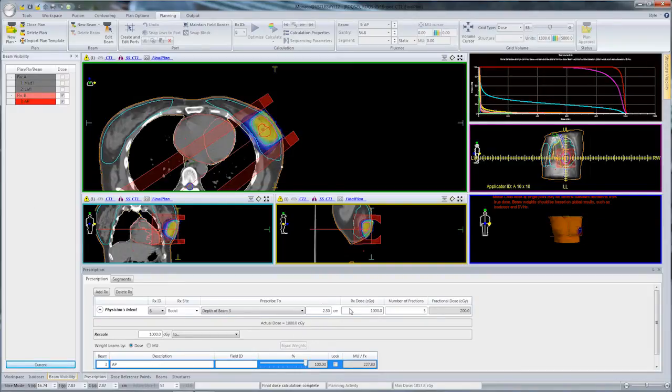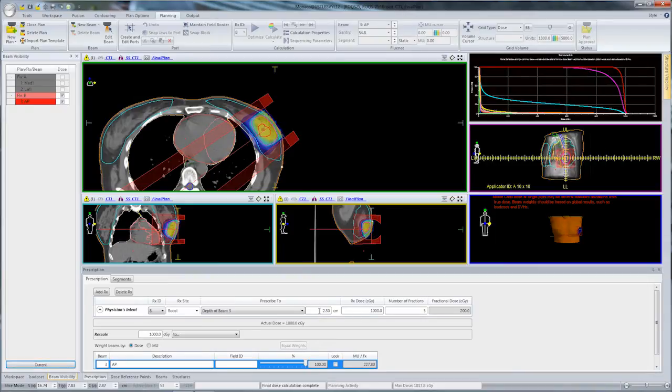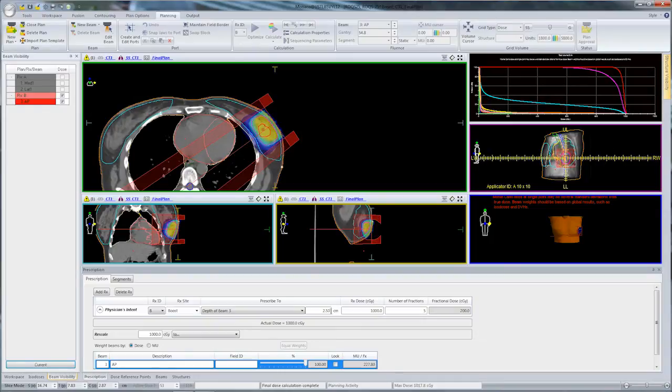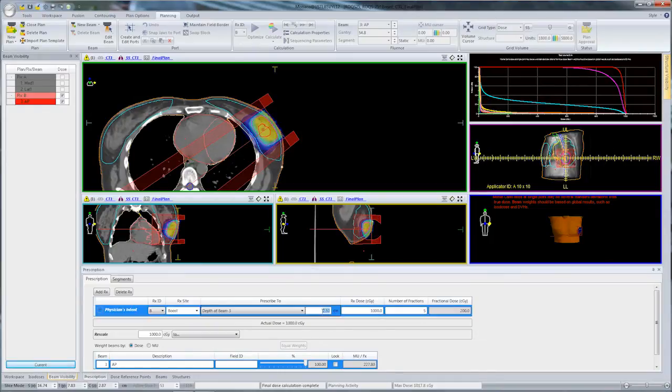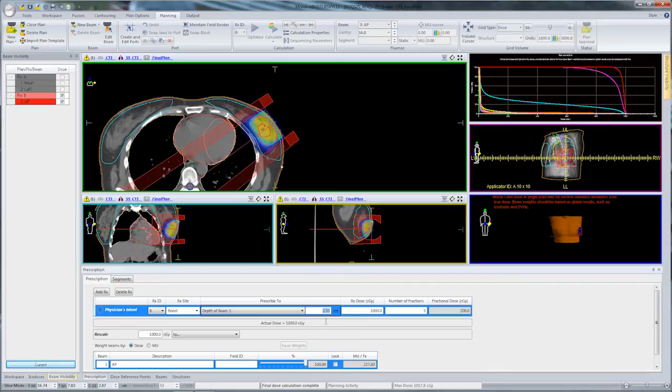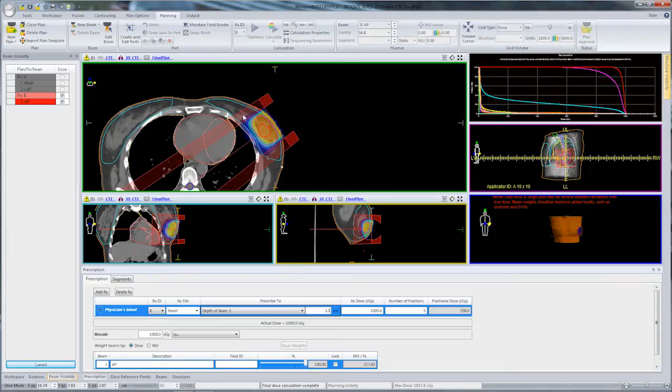We've got this prescribed right now at 1000 centiGray at 2.5 centimeters. If we want to prescribe to a different depth, we can edit the value here, maybe make it 3.5 centimeters. The dose will automatically update to reflect the new depth.